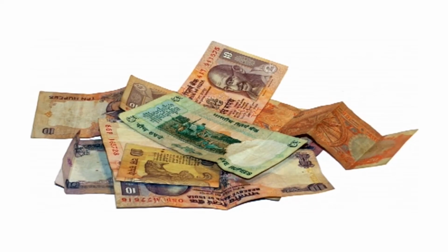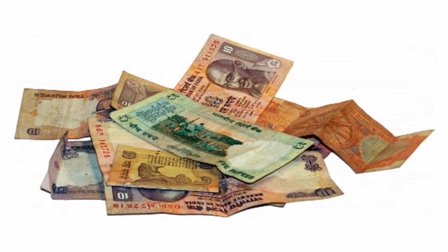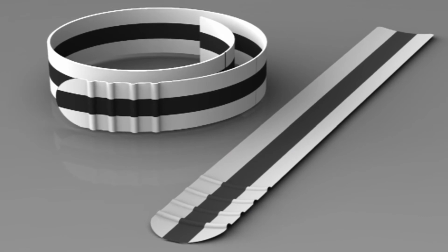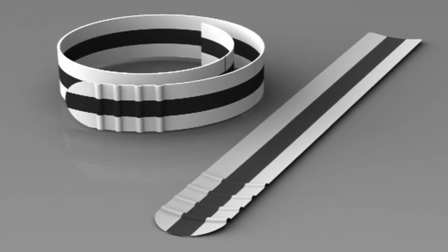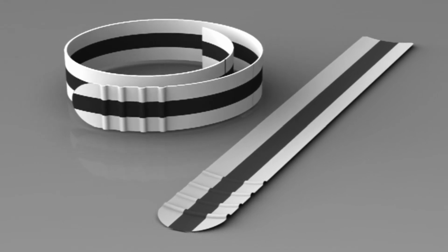The next device is a notex. It is designed to identify currency notes. It has been designed exclusively for Indian currency. It is a rectangular black sheet and has 6 cuts of different length. These 6 cuts indicate different currency notes. For example, the first cut indicates the 5 rupees note. The second cut indicates 10 rupees. The last, 6th cut indicates the 1000 rupee note.